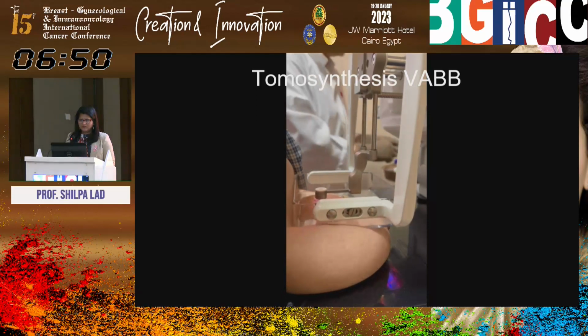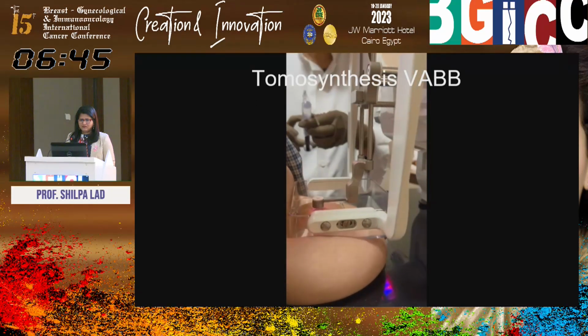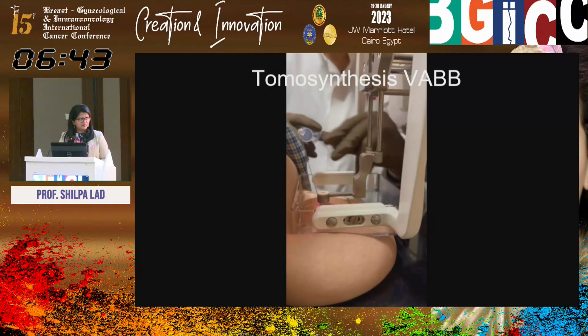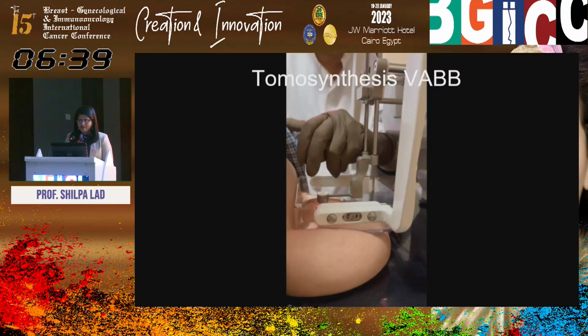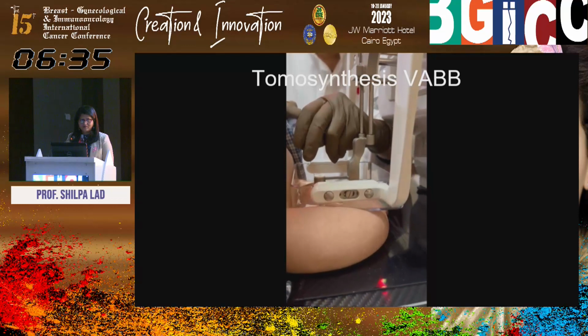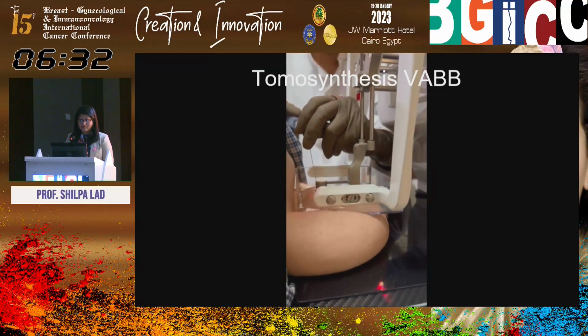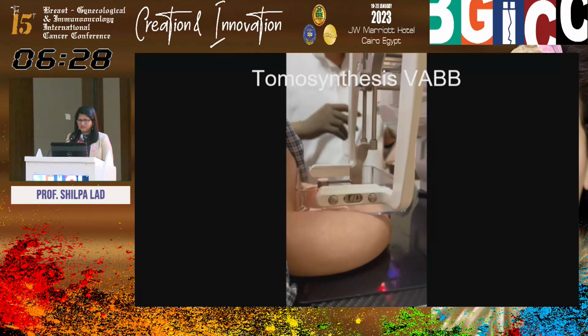Okay, and the last one that we give is bupivacaine. Bupivacaine is the longer acting local anesthetic. And it kind of helps for a little longer than lidocaine or lidocaine with epi. So that's another 5 cc. So total of 15 cc's is what is given.